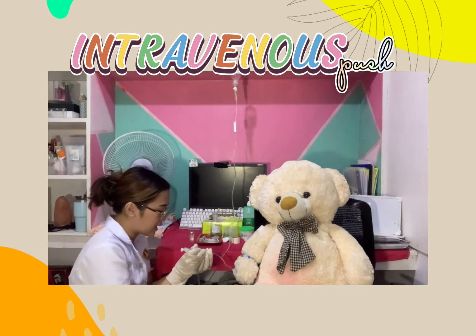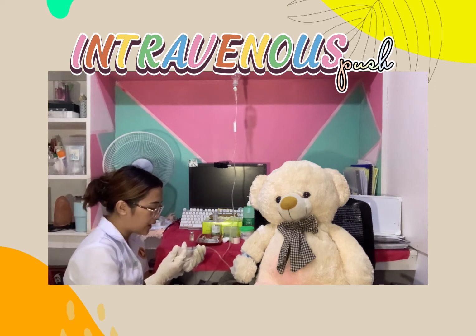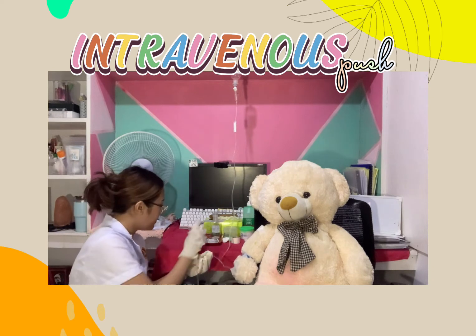So we will just also inject it at the center, and then we will draw it on the injection port slowly or for the recommended infusion rate. So we will just draw it. When the ordered medication is already administered, we will remove it again.